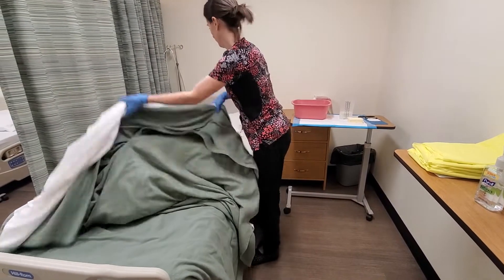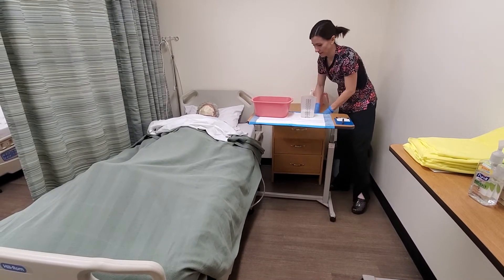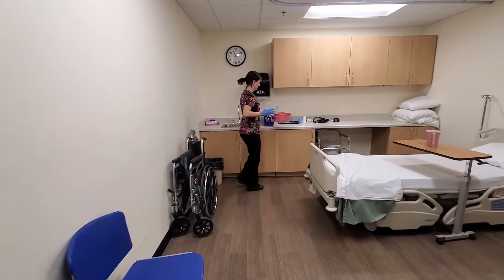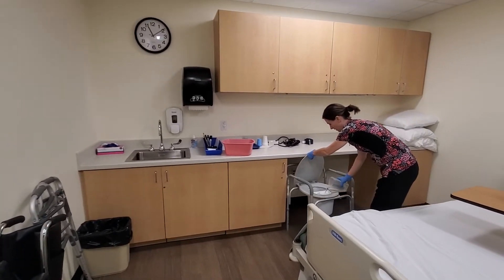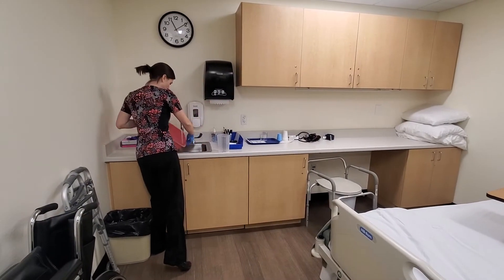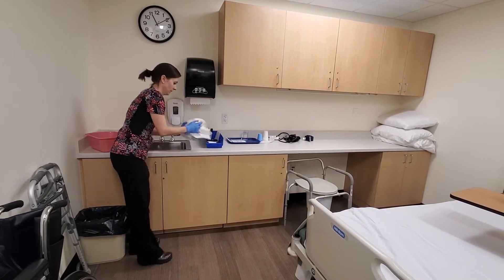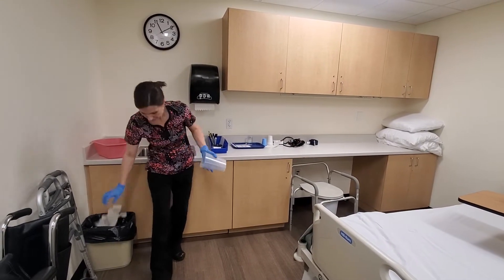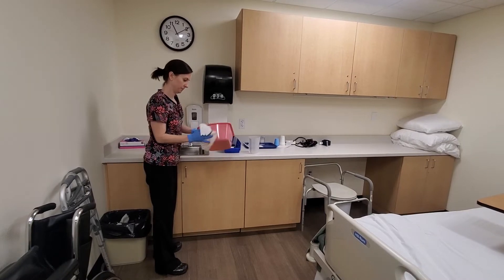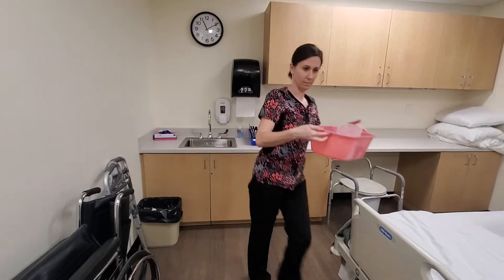I'll cover the resident back, then empty, rinse, and dry my basin and graduated cylinder. I'll dry my supplies and remove my gloves. I've got to put my supplies back where I got them from.